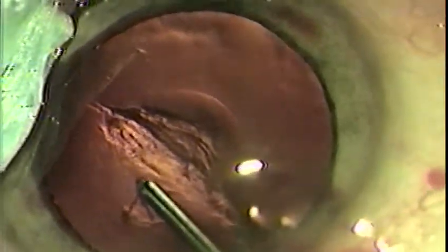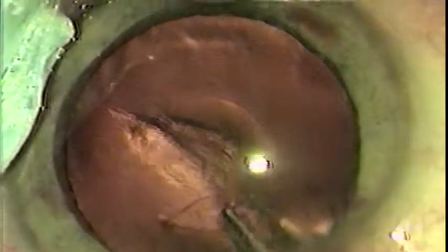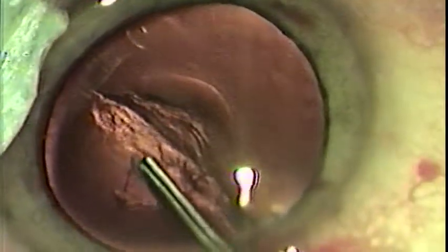Although smaller central capsulotomies aid in the implantation of intraocular lenses, they do make it somewhat more difficult for intercapsular phacoemulsification and cortical cleanup. Decide what size capsular opening is best for you and your technique.